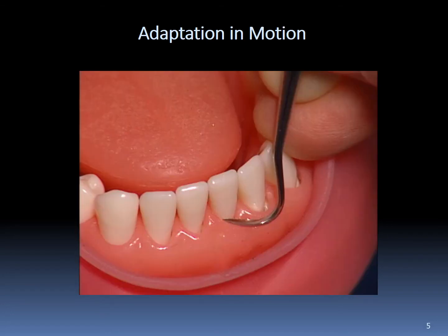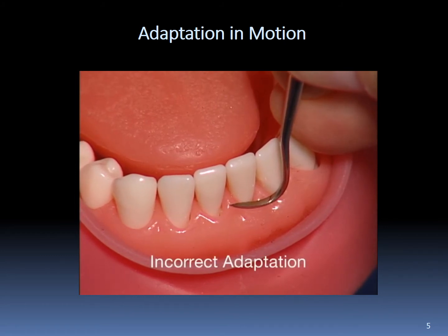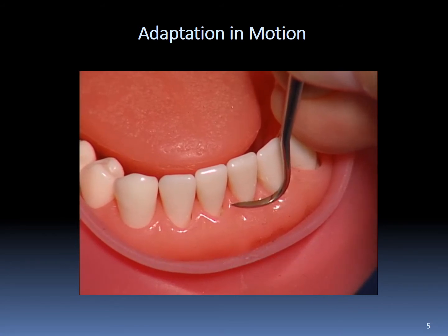Adapt the tip third of a sickle scaler to the midline of the incisor. Note that the middle and heel thirds of the working end are not in contact with the tooth surface. Now, adapt the middle third of the working end to the tooth. Look carefully at the instrument and note that the tip third is no longer in contact with the tooth. In fact, it is sticking out. Obviously, this is an example of incorrect adaptation. In this position, the sharp tip is likely to cut the gingiva.